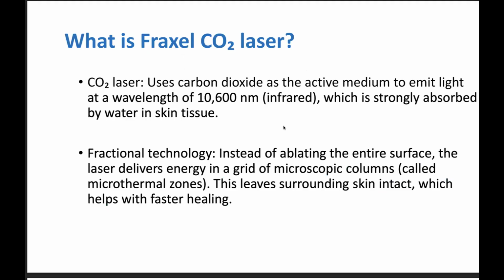The first thing I wanted to talk about is what is Fraxel CO2 laser. A CO2 laser is a laser that uses carbon dioxide as a medium to emit light. The wavelength of CO2 is around 10,600 nanometer, which is strongly absorbed by water. So the target of the tissue is water.